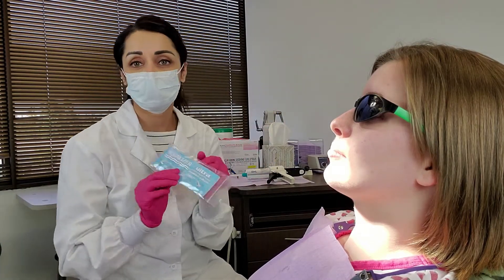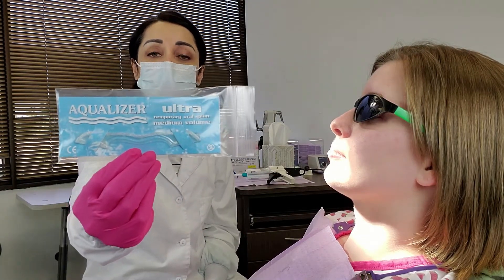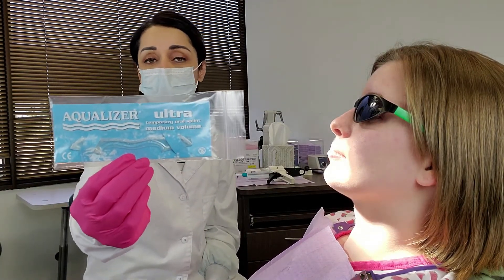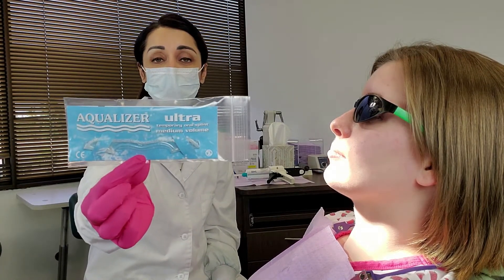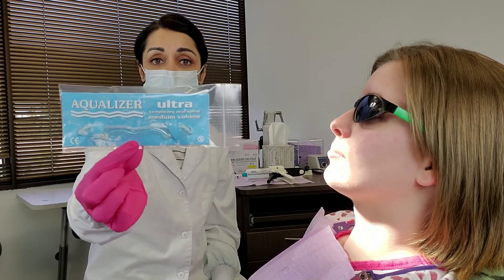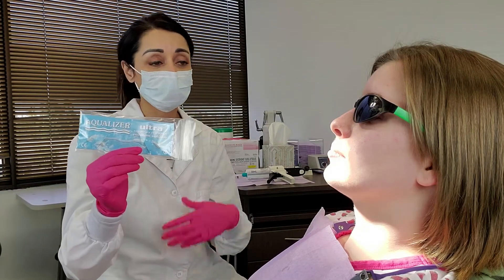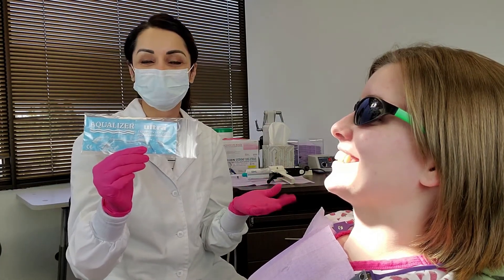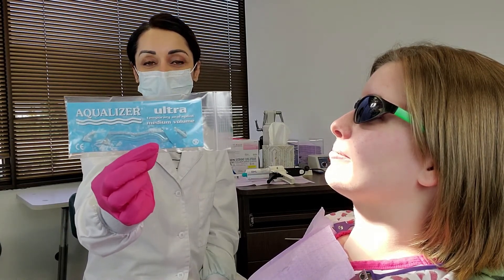An Aqualizer is this little device right here. The best Aqualizer to use for an Aqualizer Bite, in my opinion, is the medium Aqualizer. They come in low, medium, and high volume, and in a regular standard size as well as a mini. For people that are missing some posterior teeth, the mini is usually better, but since Alex has her full complement of teeth, we'll be using this medium volume regular Aqualizer.